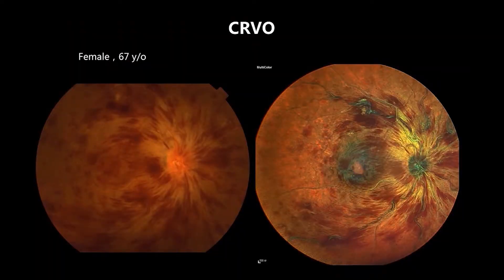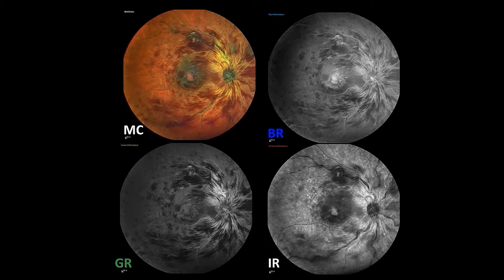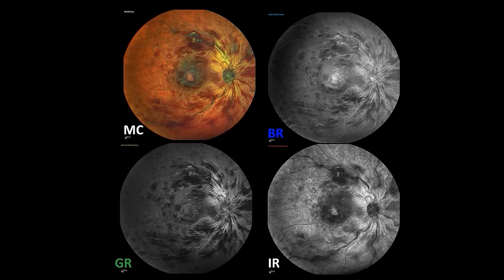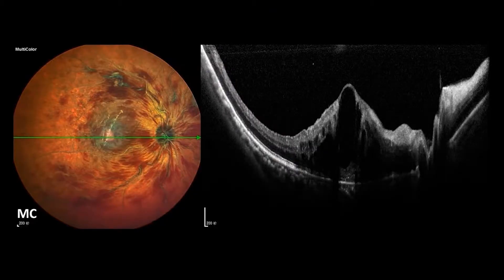In central retinal vein occlusion, retinal arteries and veins can be seen clearly in light and dark green color on multicolor image. Macular edema showed as dark green on multicolor. The hemorrhage looks more obvious on green reflectance. However, these changes do not show well on color fundus photo. Of course, OCT has the power to confirm macular edema.